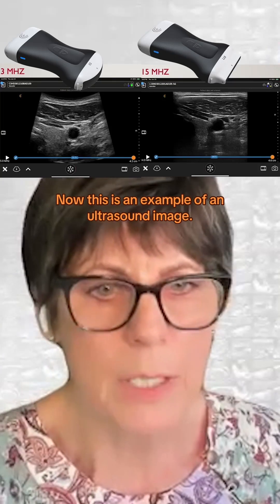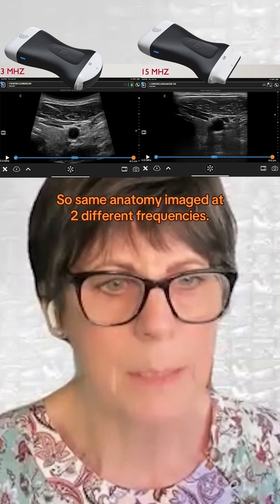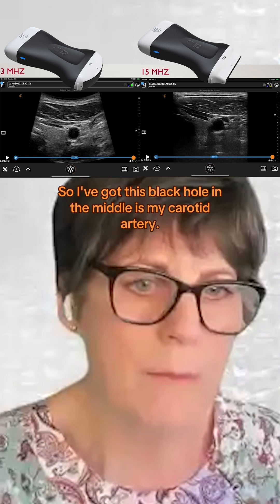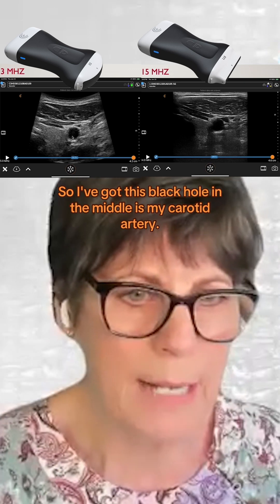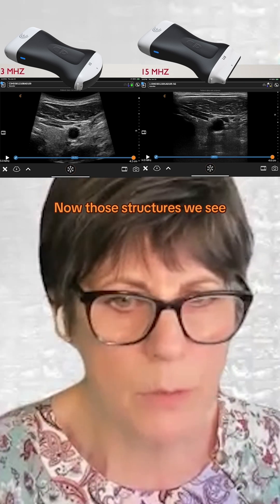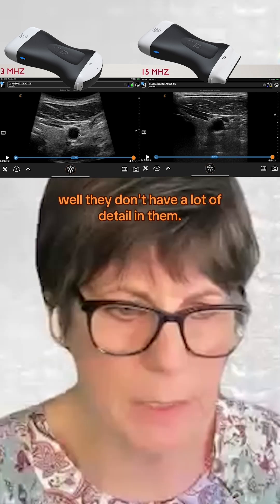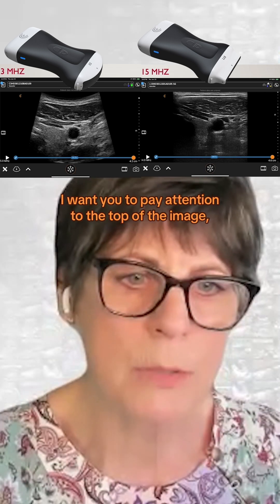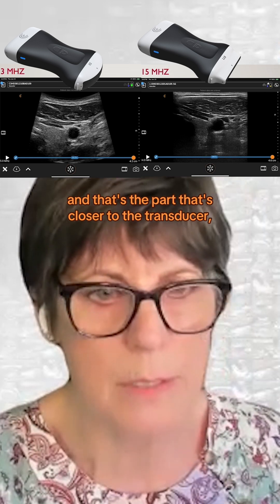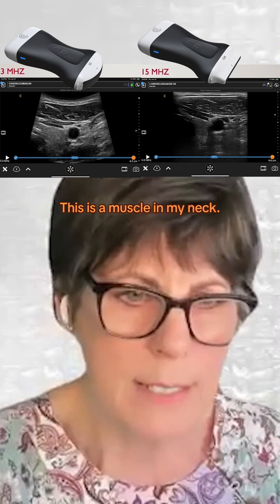This is an example of an ultrasound image — the same anatomy imaged at two different frequencies. The black hole in the middle is the carotid artery. I want you to pay attention to the top of the image, which is the part closer to the transducer — the more superficial structure.